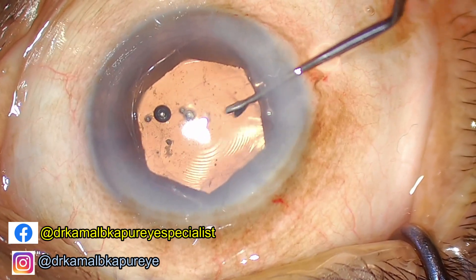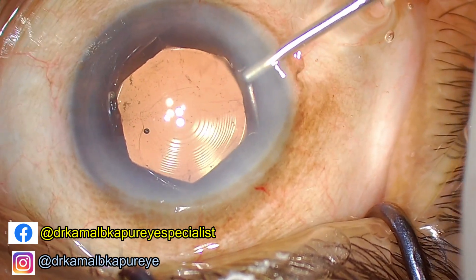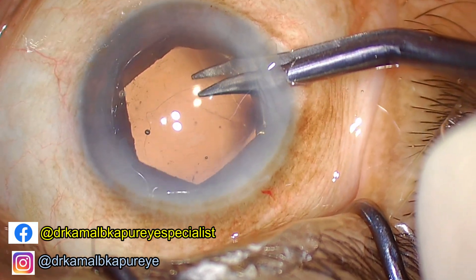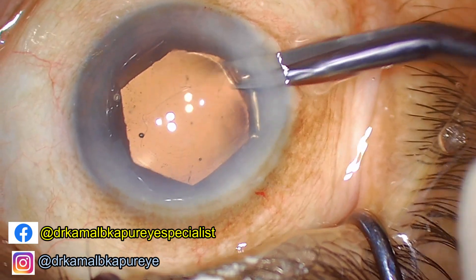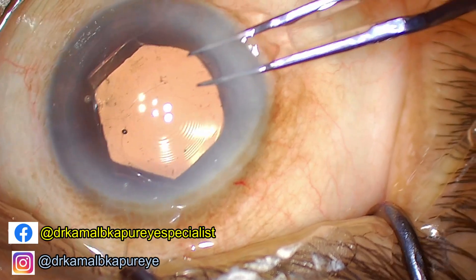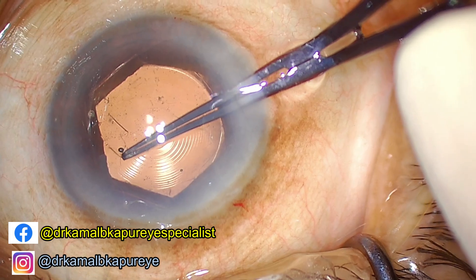Now my trifocal lens is inside the eye, so we proceed to do the capsuloplasty. We start by creating a radial nick in that part of the capsule which needs to be extended. Having done so, I hold one lip of that small nick and extend the capsule rhexis, trying to make it a circular or slightly bigger oval capsule rhexis — and there you see we have extended it again.